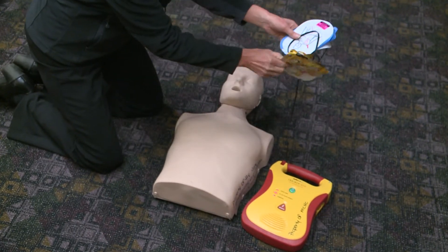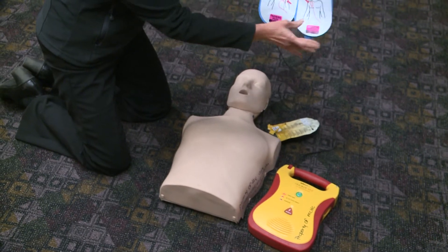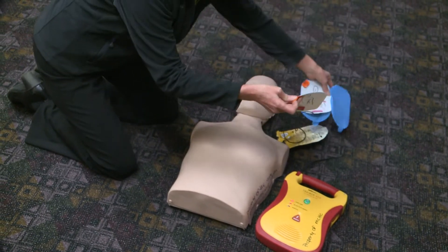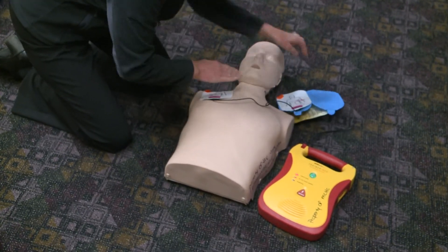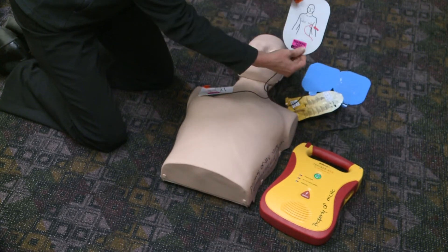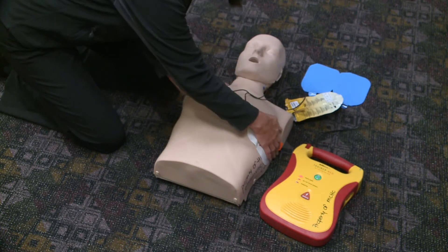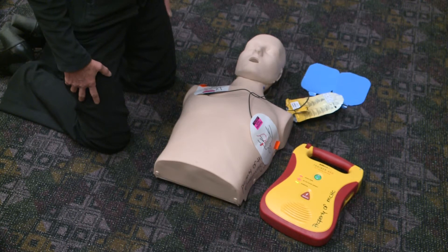Analyzing heart rhythm. Analyzing interrupted — do not touch the patient. Apply pads to the patient's bare chest as shown. Analyzing heart rhythm. Do not touch the patient.